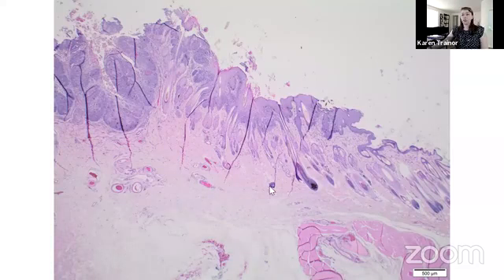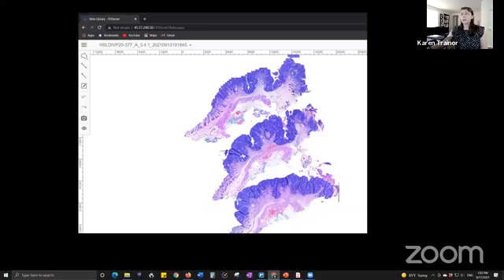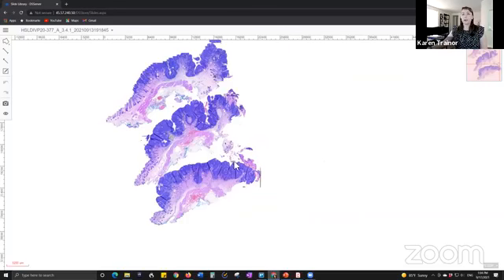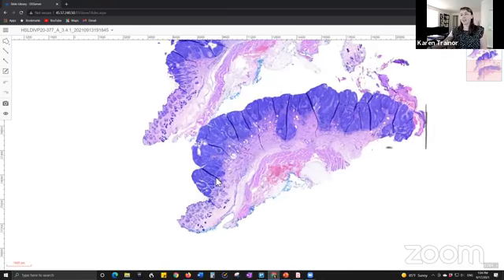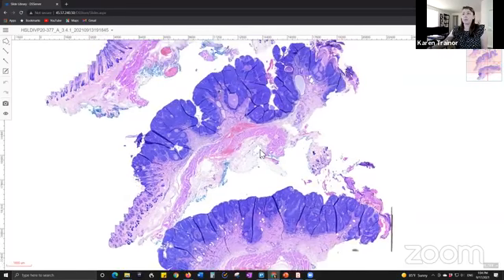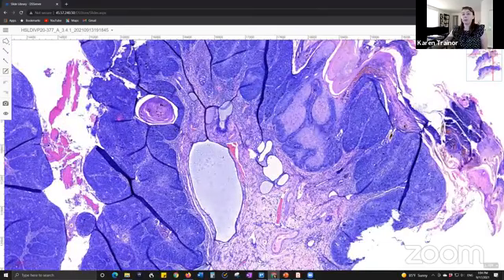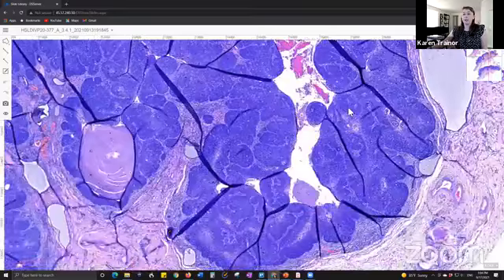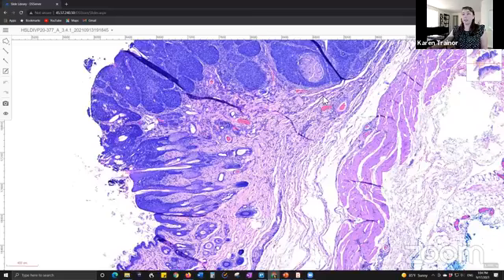So we'll switch over to these slides. When we look at low mag at the histopath, you can already tell there's going to be something good going on here. We have a large raised plaque-like lesion, and we also have an area of infiltration as well. That's what we can see here at low power. If we go a bit closer, we can see that the epidermis is all thickened, and it's primarily an epidermal tumor, and then there is invasion into the underlying dermis as well.